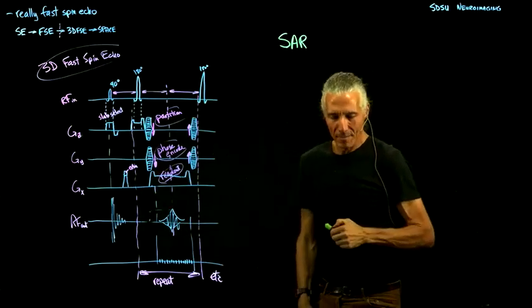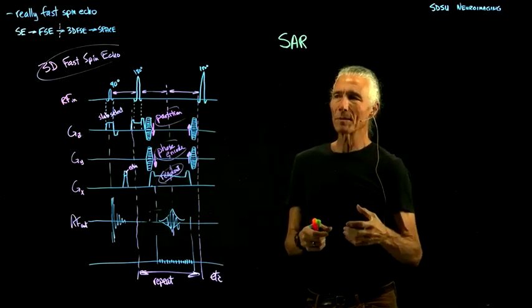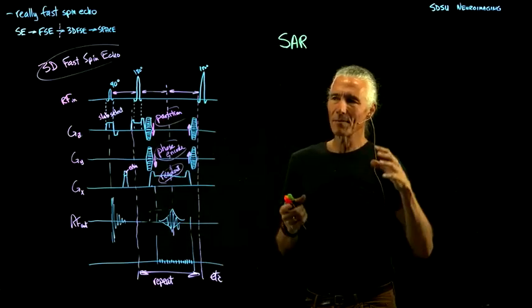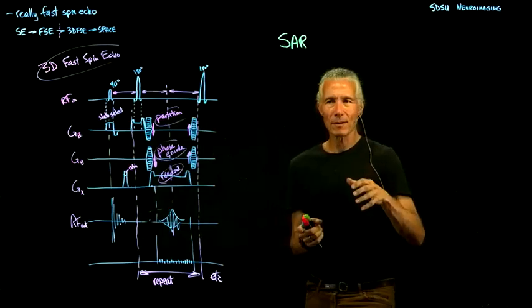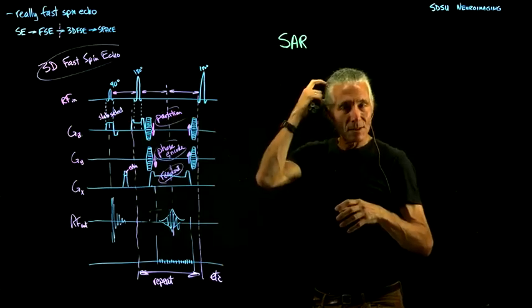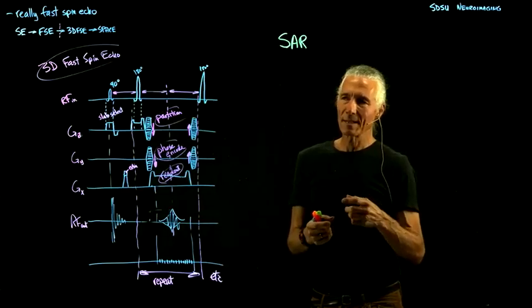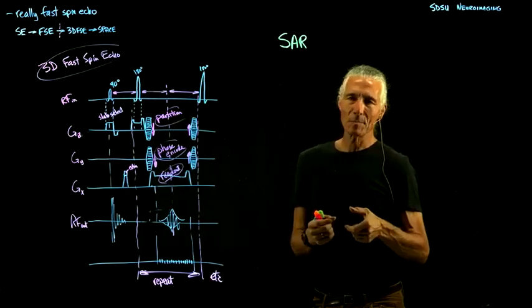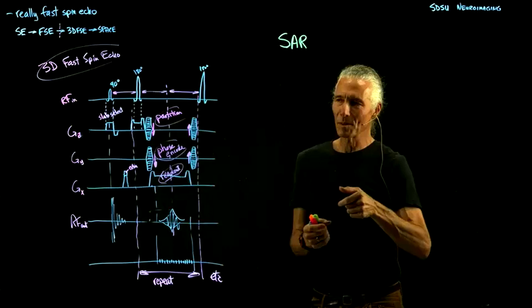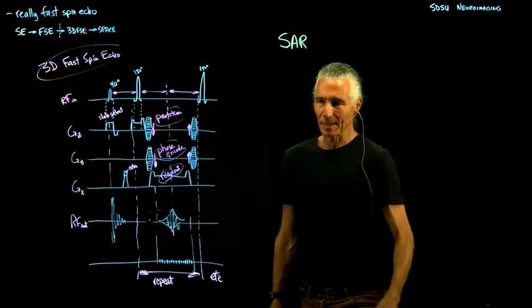So how does the scanner actually measure this? The scanner directly measures how much RF has been absorbed. There's actually another little antenna, a detector, inside there. If you do an RF pulse, turn on the transmitter, that will generate some radio waves. They'll go into the head, and a certain percentage of them will be absorbed and will affect the spins and invert some of the spins. At the quantum mechanical level, it'll flip some so that they're in the opposite orientation from the B0 field, and it will line up their phases.